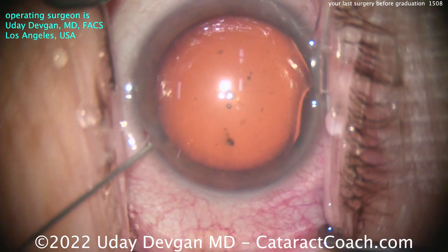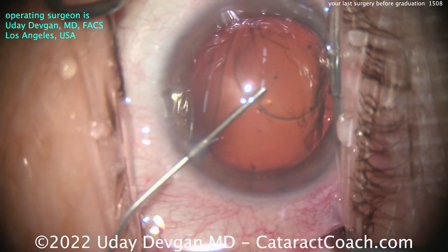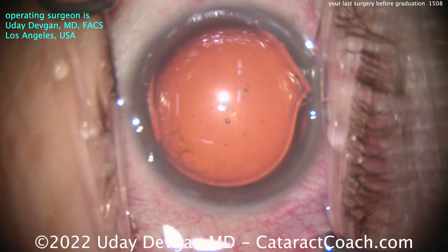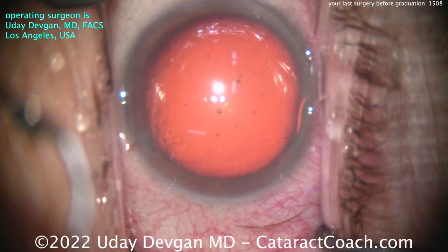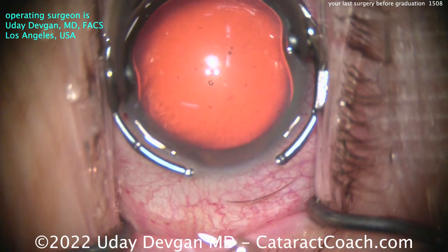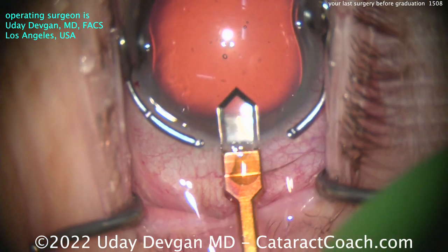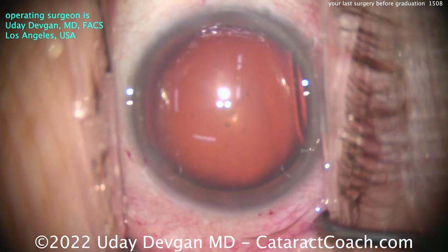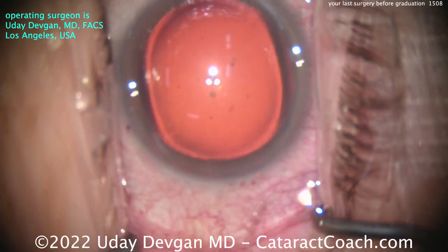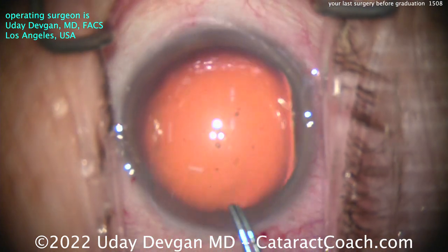This is a routine cataract case, but you need to know how to do a beautiful routine case. Step one: look at the draping — no lashes in the way. We used copious irrigation at the beginning to clean up the tear film. Good viscoelastic. The incision is so important. Here he's using a diamond keratome, making a good single-plane incision, getting to the appropriate width. Notice how it barely nicks the limbal vessels — that's going to ensure great long-term sealing of the incision.